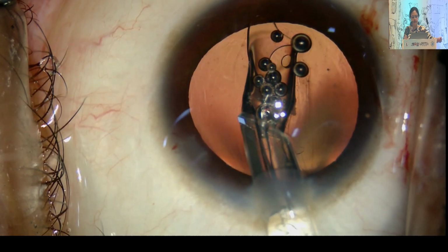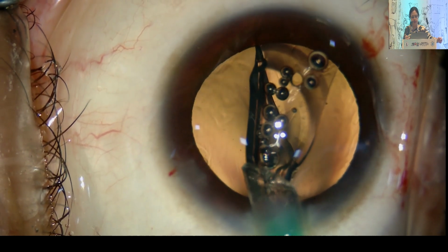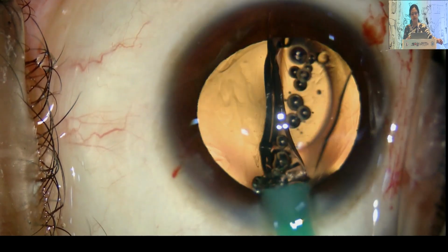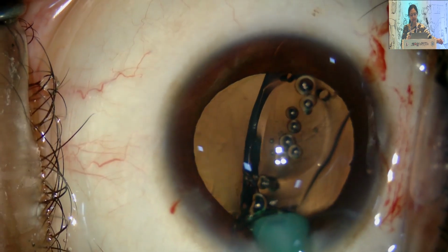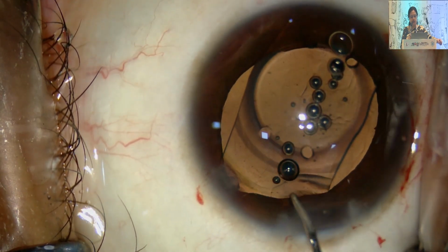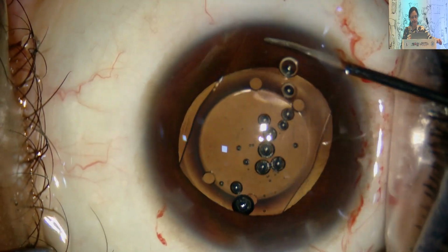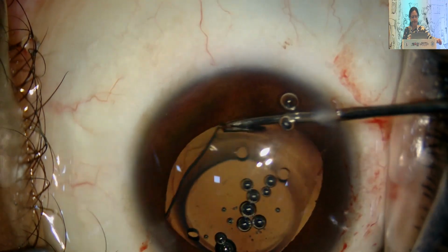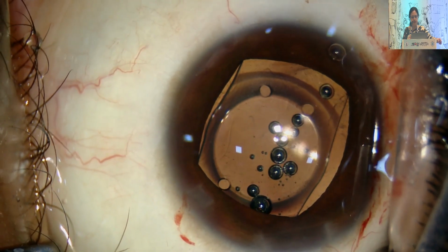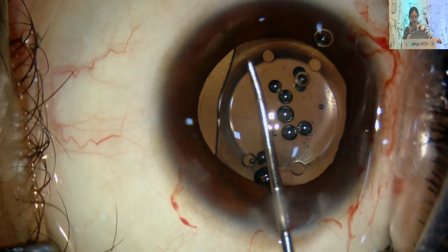You can see that the lens is a little bit flexible, so you have to make sure that you are putting it on the right side. The small hole in the haptic helps us to identify which is the right side. So the hole is on the right side in the superior haptic and the left side in the inferior haptic. So it's very easy to tuck in, extremely flexible, and it can be done by any surgeon. It's not a big game changer.